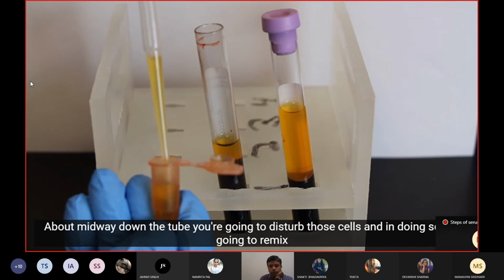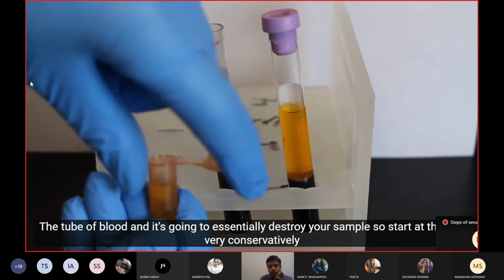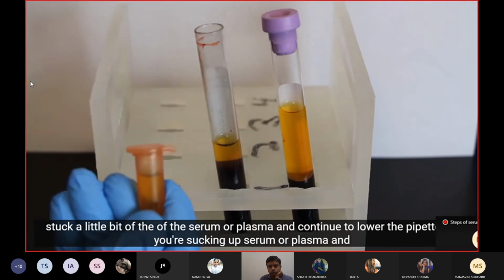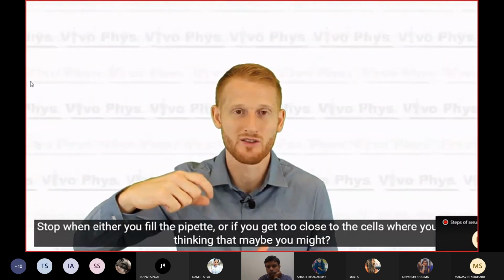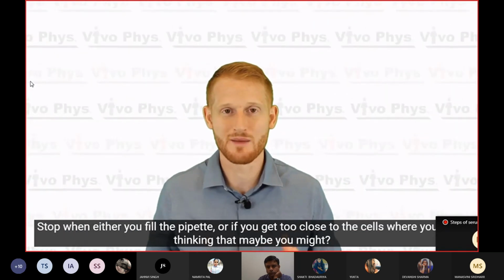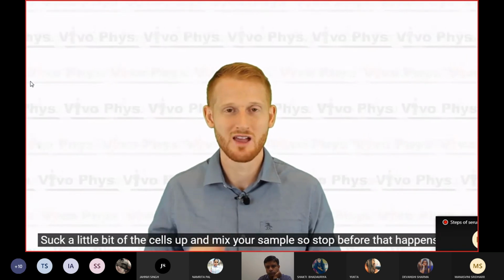And doing so is going to remix the tube of blood, and it's going to essentially destroy your sample. So start at the top very conservatively, suck a little bit of the serum or plasma, and continue to lower the pipette as you're sucking up serum or plasma, and stop when either you fill the pipette or if you get too close to the cells where you start thinking that maybe you might suck a little bit of the cells up and mix your sample. So stop before that happens.